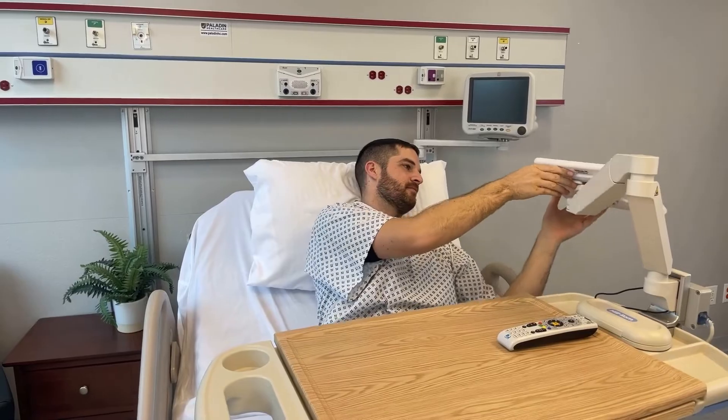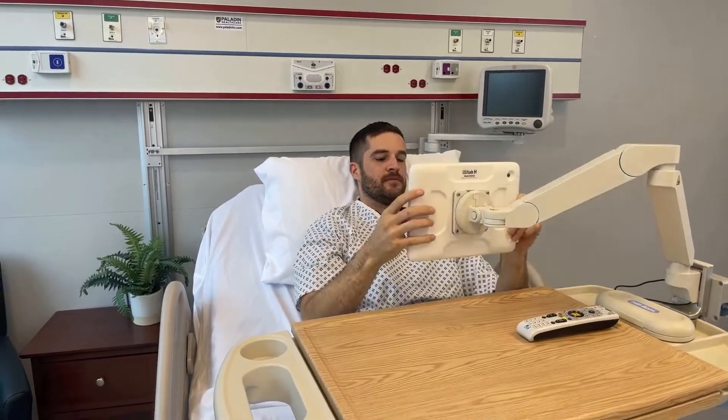To learn more about the tablet integration upgrade kit or for questions on other GCX solutions, please contact your local GCX sales rep.